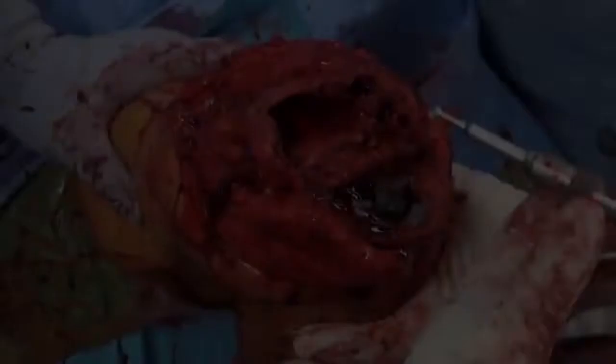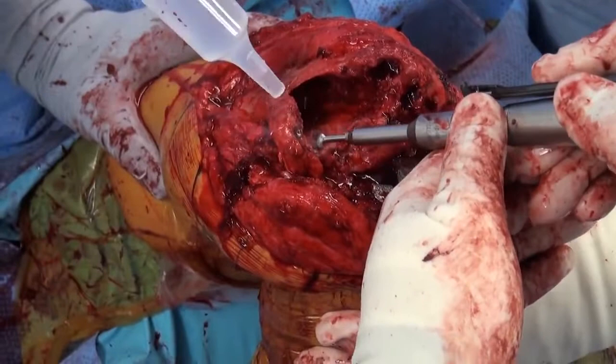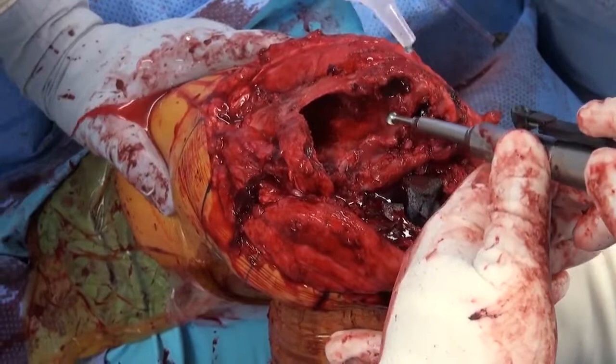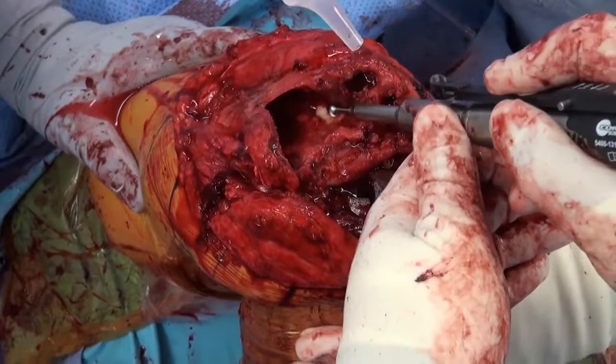The burr is then used to further fashion the bone along the lateral and posterior aspects to allow placement of the femoral cone into a somewhat deeper position. Here on the medial side, additional work with the cone removes minimal amounts of bone while still maintaining the relative shape desired to match the cone contour. It's necessary to work back and forth with the trial and the burr in order to remove small amounts of bone gradually to achieve a satisfactory fit.